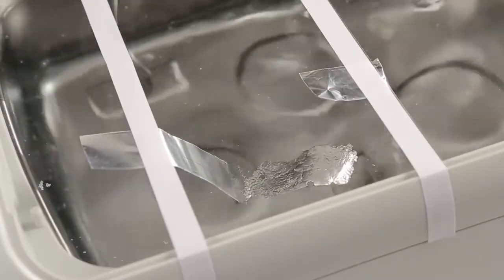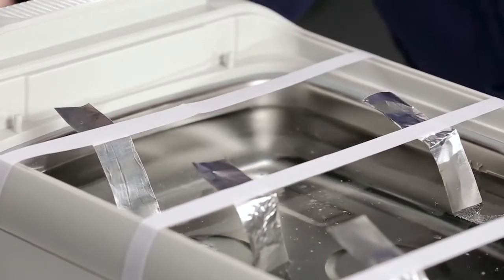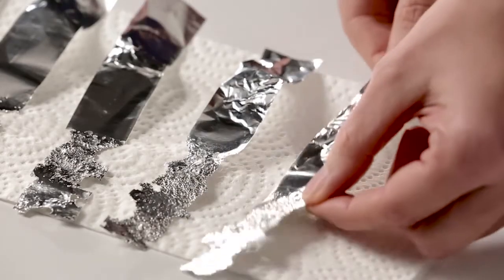Run the cleaner for three minutes. Remove the foil strips from the bath and place them on a paper towel. Examine each strip for pitting and holes in the foil.